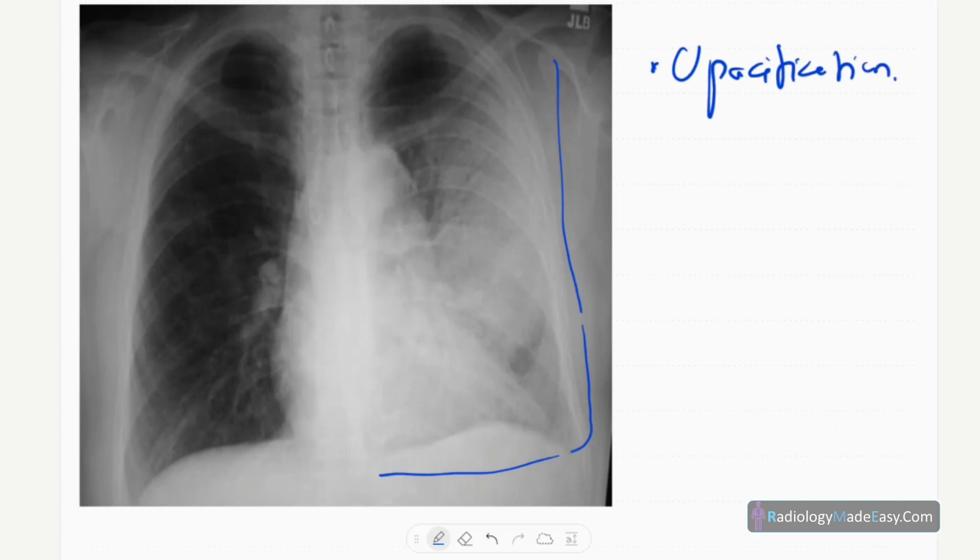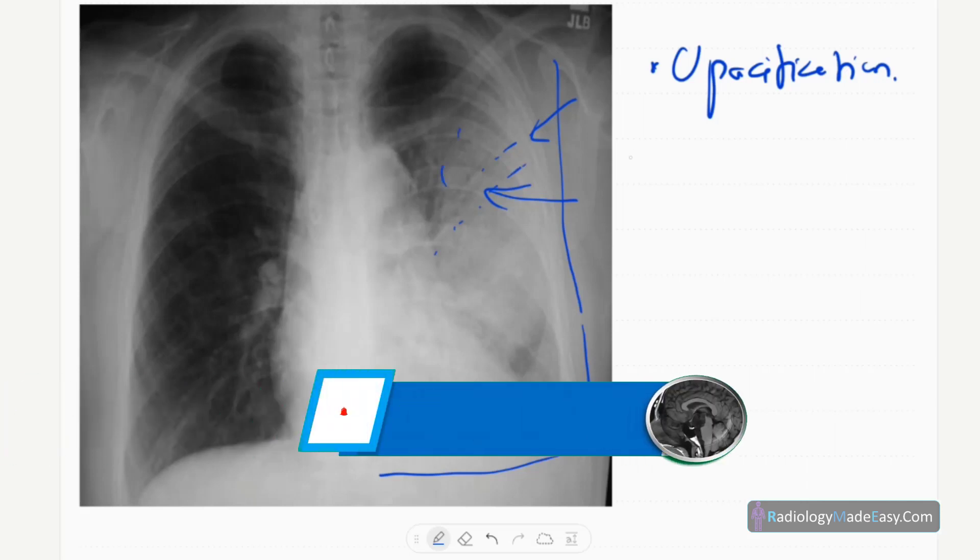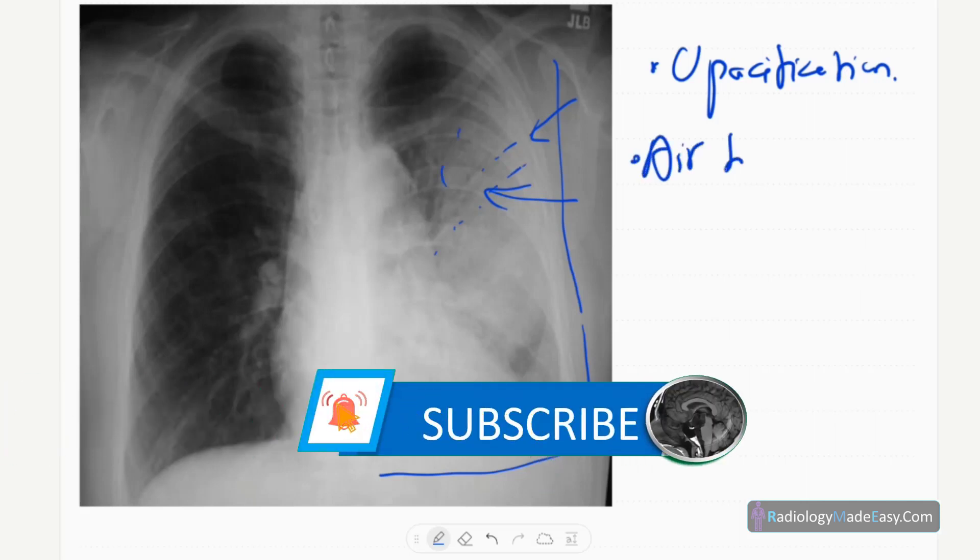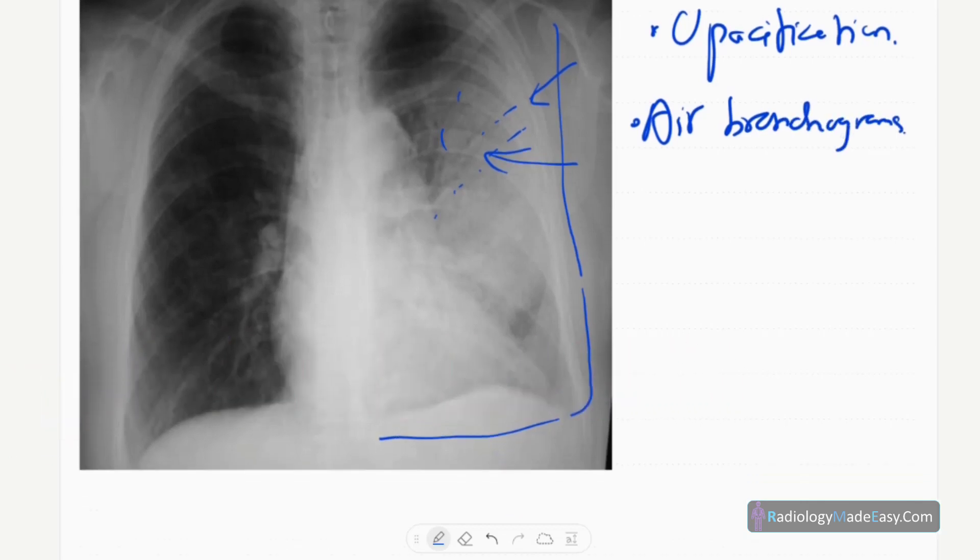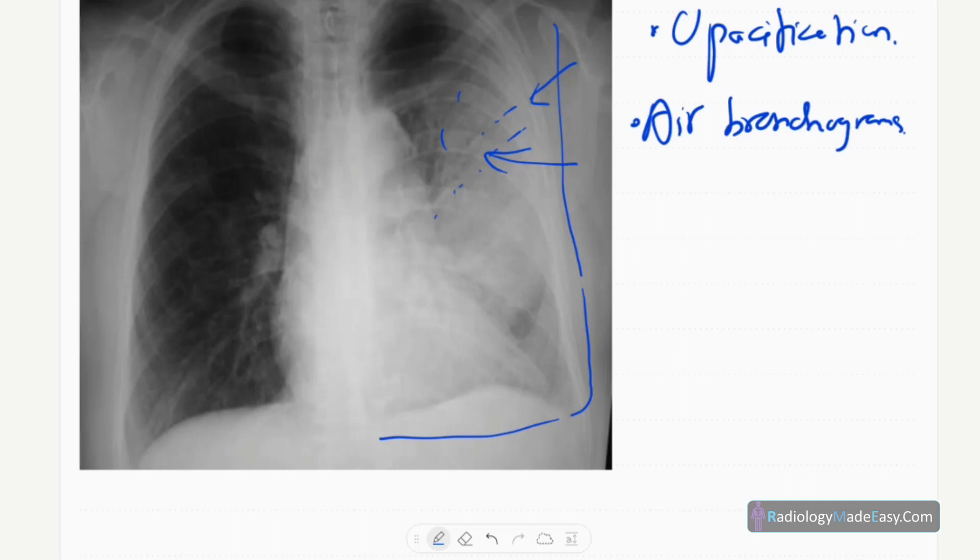There are some linear lucencies—those are called air bronchograms.